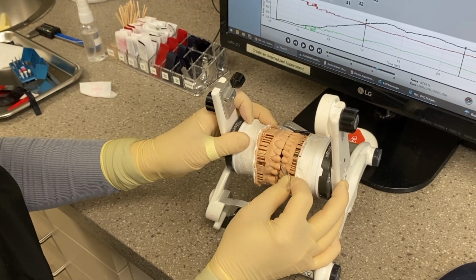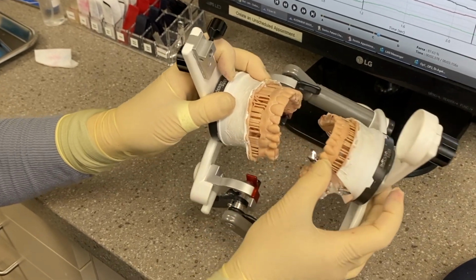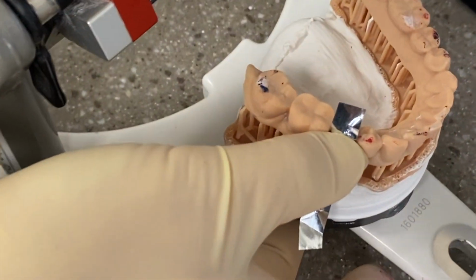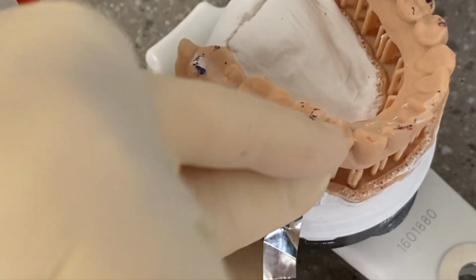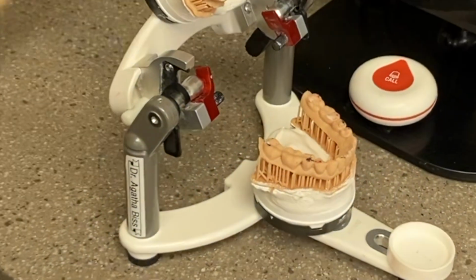You really want to sometimes feel it or have the shim stock leave a mark, because you can see it. Can you see that line right there? And underneath it tells you it's that cusp right there. So we're going to just tuck that in a bit.